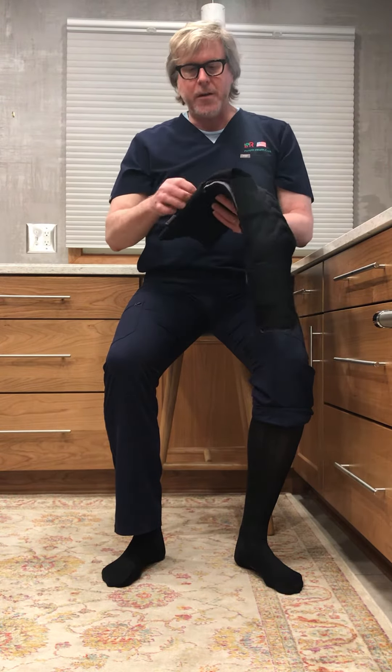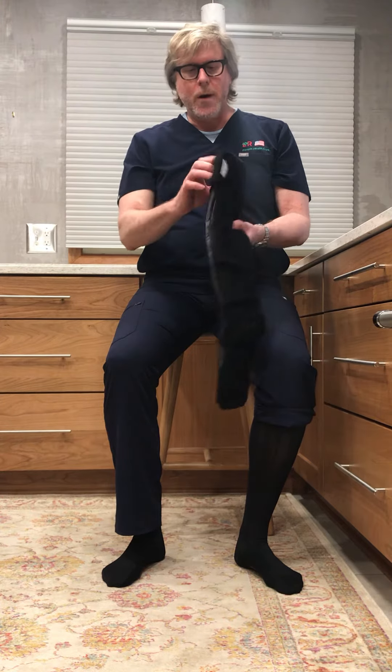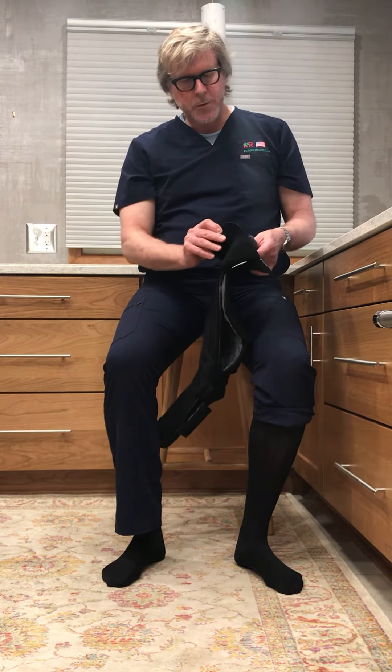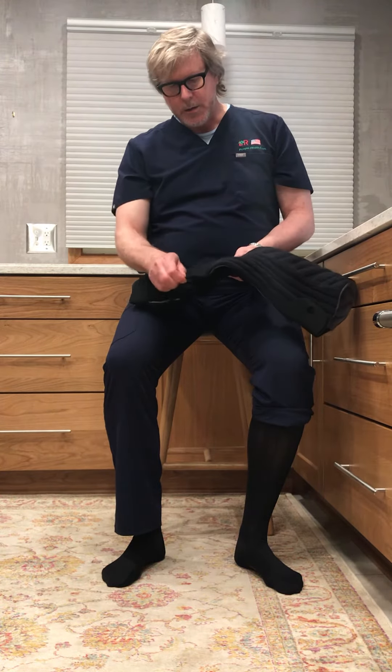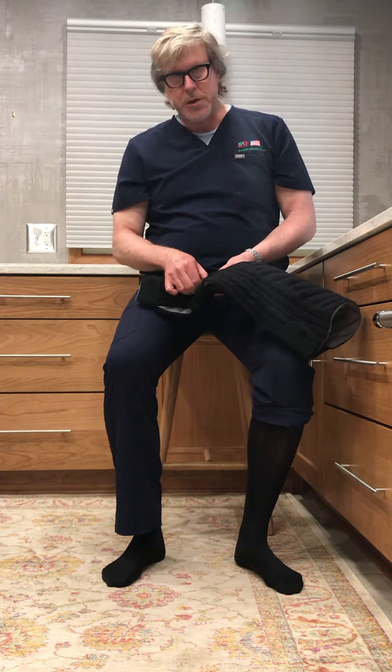There is a wide strap at the very top of the calf. You're going to want to leave that fastened, but loosen it up a little bit to make it easier to get on. And then there are two narrow straps at the ankle — loosen those up a bit as well.